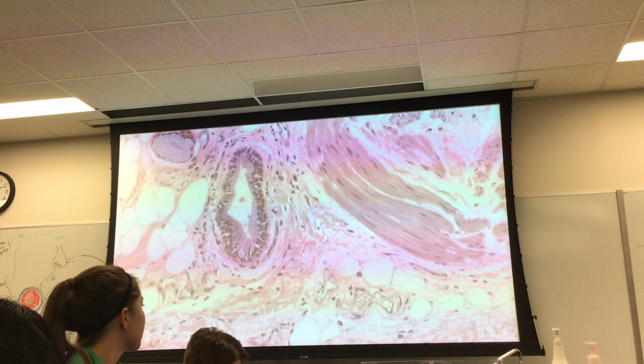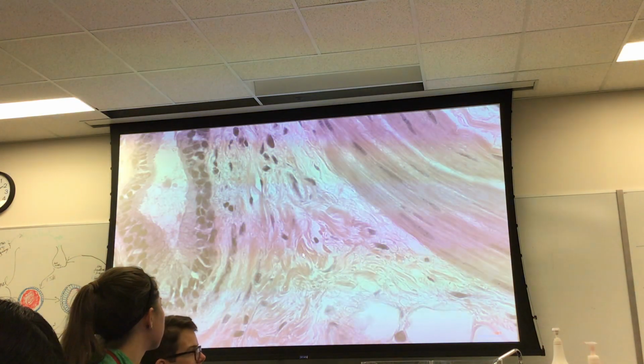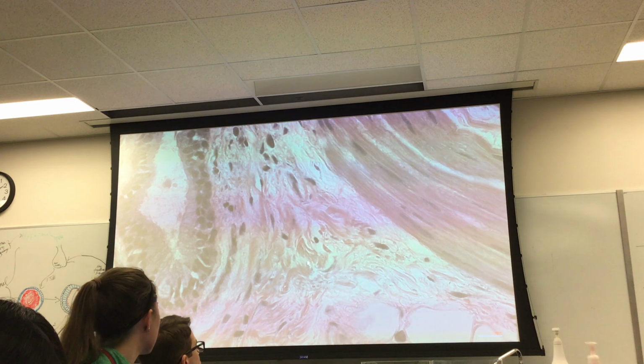Because they're too, in fact, let's increase our magnification. There's too much variability here. So these are individual collagen fibers.